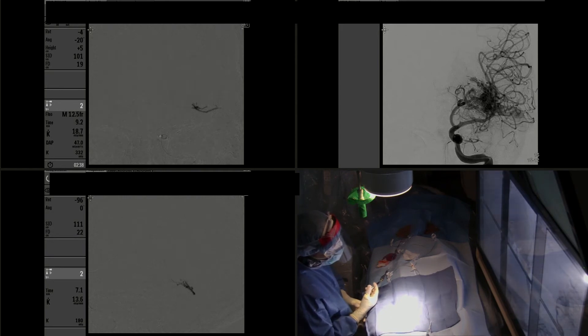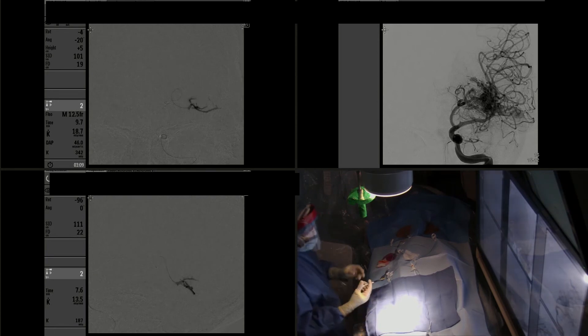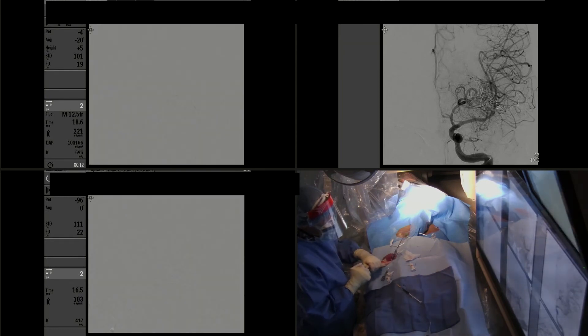We do not want the Onyx to go into the venous side this early into the injection, given that the feeders to the malformation are still patent. We are continuously watching for any potential reflux of the Onyx into the microcatheter proximally. Whenever there's reflux, like you're seeing at this point, we stop the injection to allow for the Onyx to solidify before we continue to inject the embolic material.